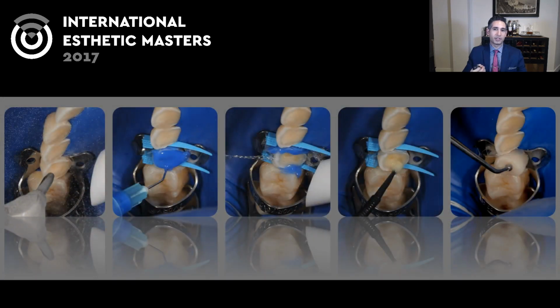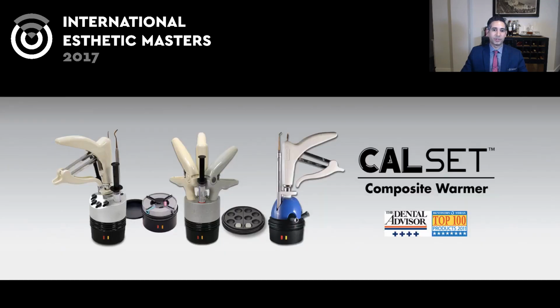So my bonding protocol in a nutshell would be to use composite warmed up. Now that we have this immediate dentin sealed layer and we come back to cement these restorations, what you want to do is aerobrade to clean the surface and roughen the resin, because aerobrasion is really the best way to bond composite to composite, and it can create a very strong bond. So you aerobrade, then you etch everything, especially the enamel, and rinse it off, get everything clean, and apply adhesive only at this point because there's no more dentin that you're trying to bond to. Then you apply adhesive to the restoration as well after you've conditioned the restoration, and you use composite, and you just have to apply pressure and clean.